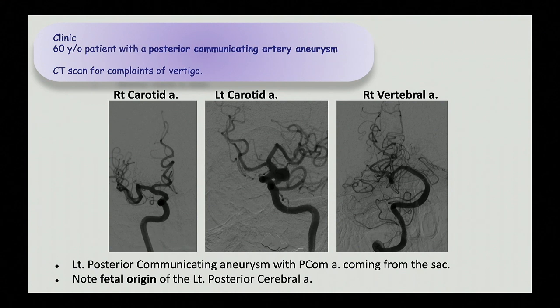So I was really wondering what was the best treatment for this patient. Really not easy to treat the aneurysm. There is no PCOM from the vertebro-basilar system. So there's a risk to occlude the posterior communicating artery, and the morphology is not so easy. So ideally, you want to treat the aneurysm, but to keep this branch open, and so the anatomy is not very easy.